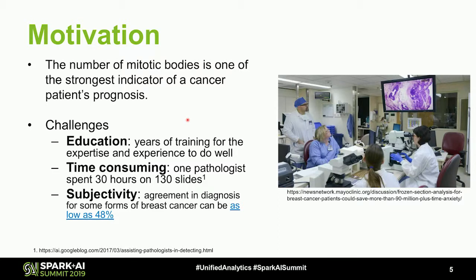Motivation. This project wants to answer the question of where the mitoses are located in a high resolution stained medical image. Normally it requires a few years of training to get enough knowledge and hands-on experience to answer this question. And even for an experienced expert, it still takes a long time to examine the image. For example, in the right image, the expert needs to use the microscope to zoom in on the image and examine the slides one by one.